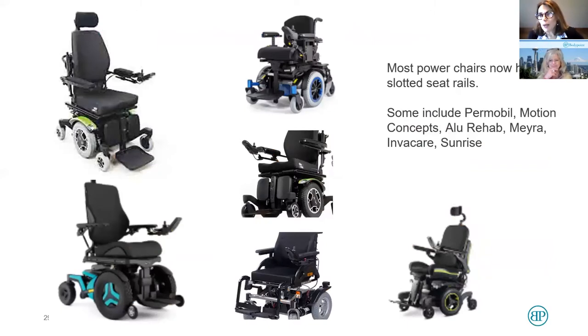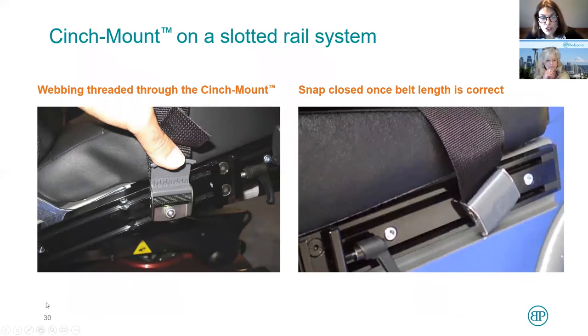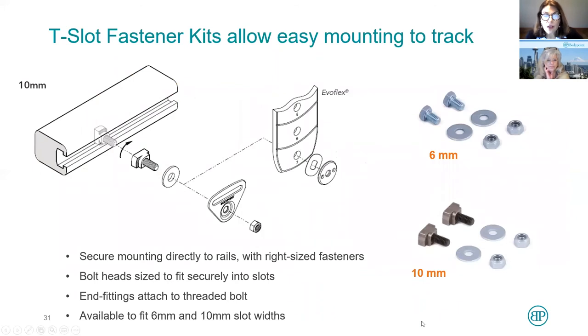Now let's talk about power chairs. Most of our power chairs now have slotted seat rails. This shows a cinch mount attached to a slotted seat rail — there's a bolt in the slot and then the bolt sticks out with a nut attaching to it. You can often slide to get just exactly the right angle you want on the slotted rails. You can also attach a flat mount to the slotted rails, with the head of the bolt in the slot, and with the bolt coming out — a washer, a flat mount, and a nut to attach. Our T-slot fastener kits come in a 6-millimeter head and a 10-millimeter head.